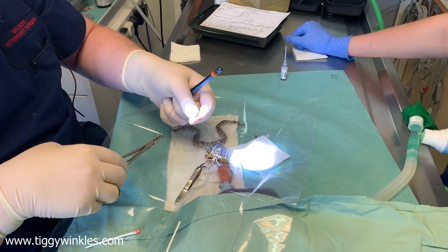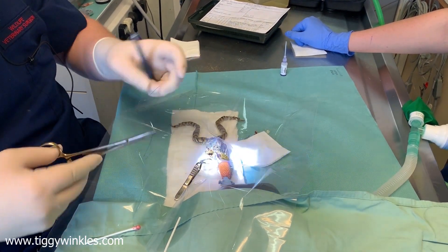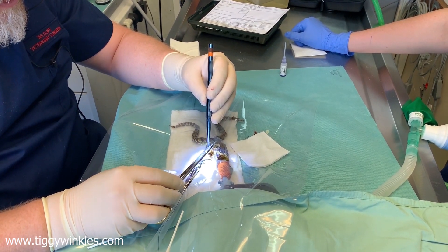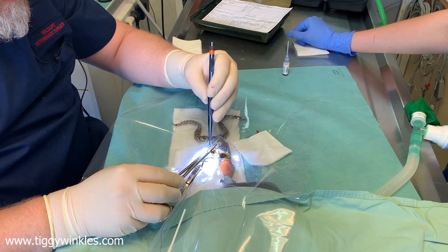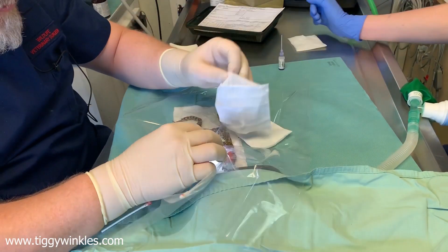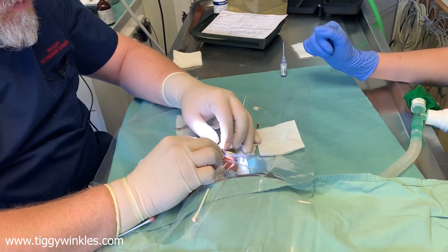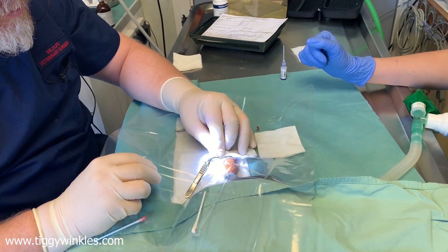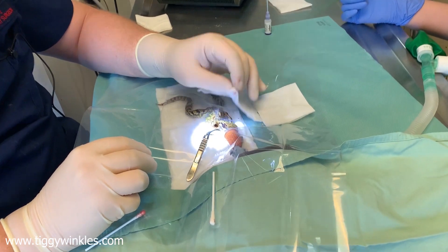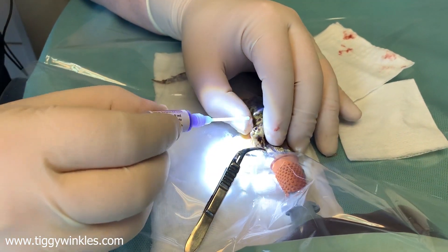One stitch, and maybe a second, maybe a third — we'll just see what space we need to cover. That covers it quite nicely, so just a second stitch will be enough and then we'll be done. Swap the end and check there are no gaps. That looks nicely sealed, and I'm going to put a small amount of tissue glue just on the edge to try and seal it so he's watertight.